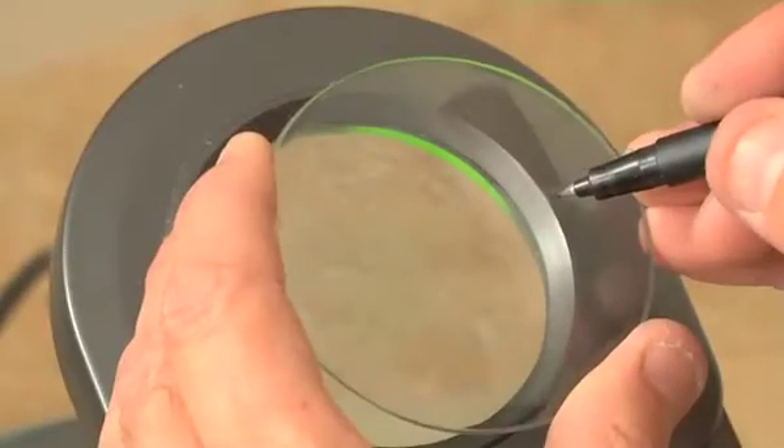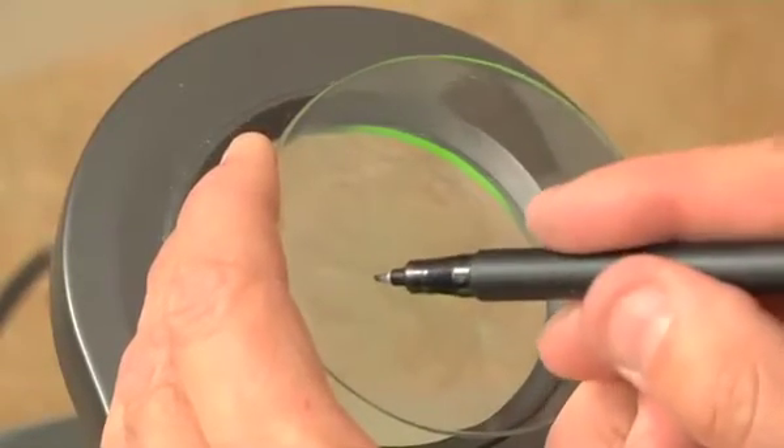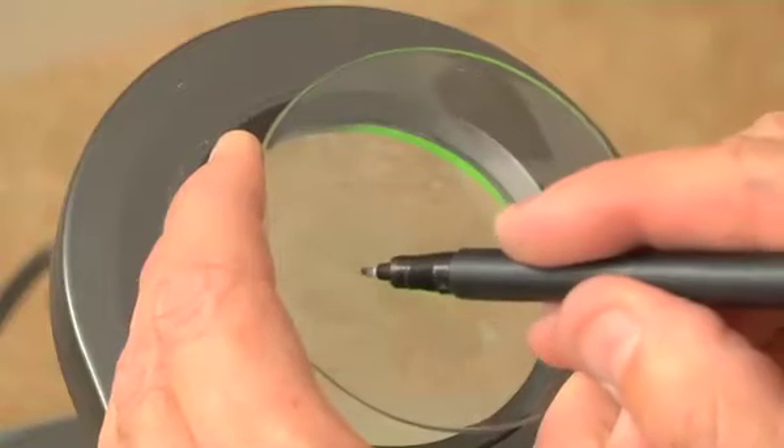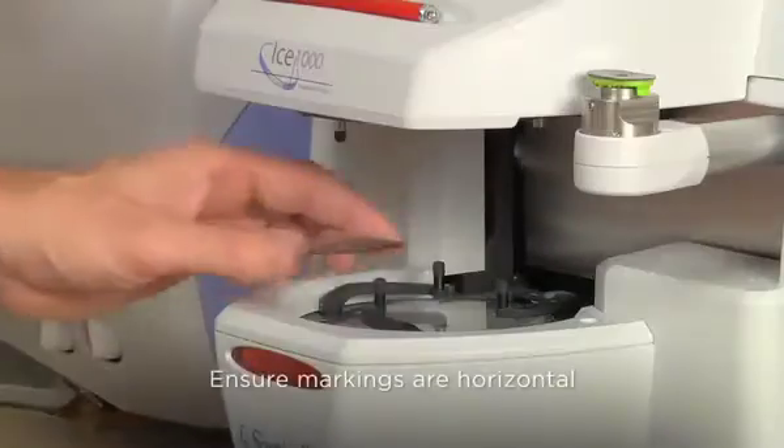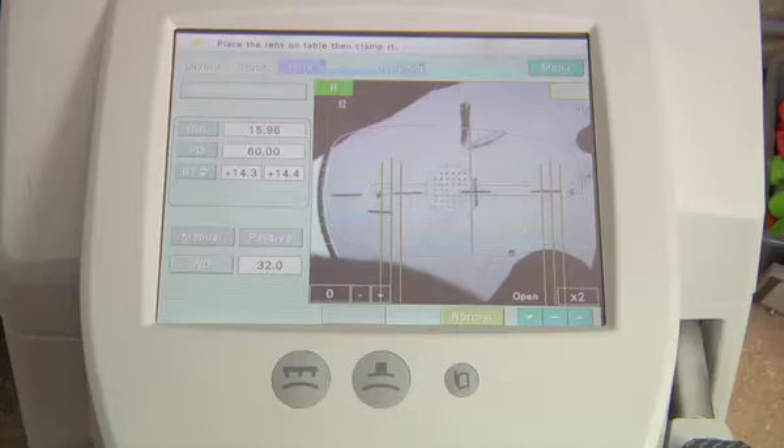The proper orientation of Transitions Vantage lenses is denoted by angle brackets on the edge of the lens and 2T or plus marks 20mm off the center of the lens. Place the lens on the blocker with the markings on the horizontal axis.